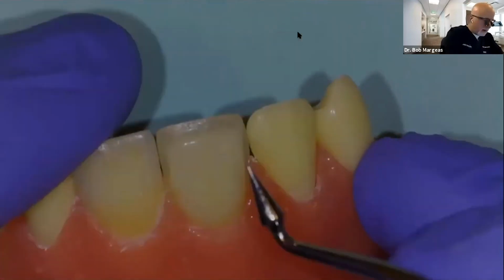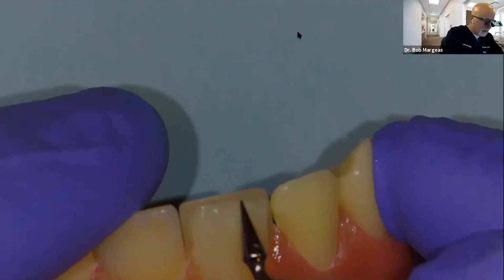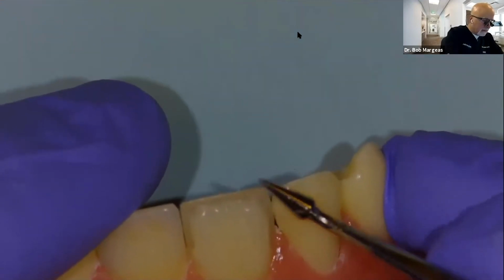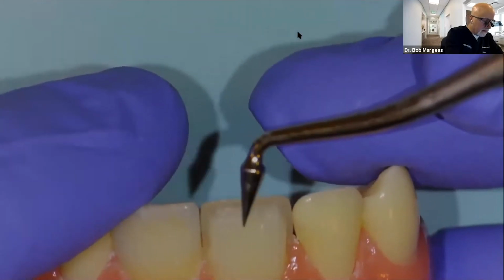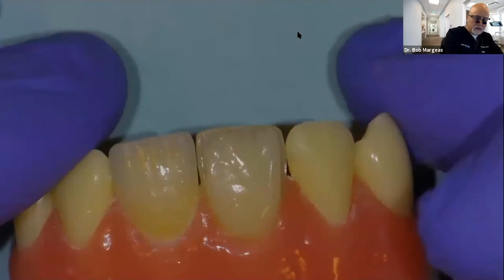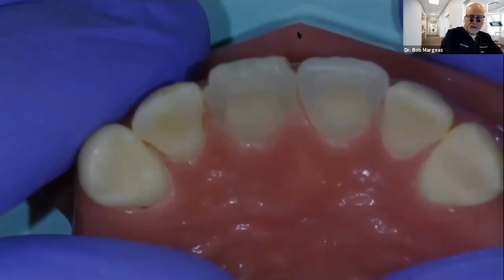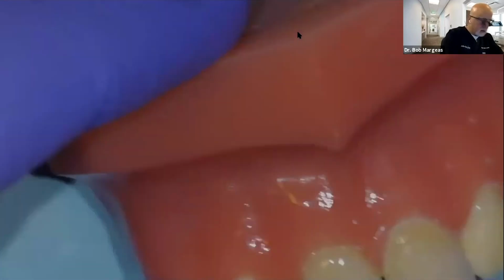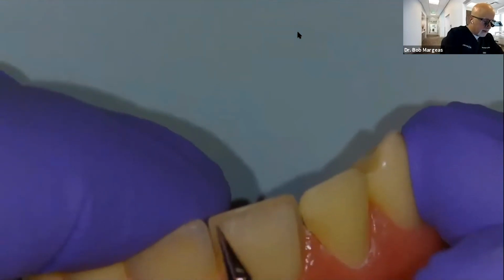So now I want to be able to create those dentinal lobes. So I'm actually splitting the material, keeping it short of the incisal, trying to determine how much material you need. If you look at this, you can see I'm a little bit over contoured, not bad, but I've got to try to create these developmental lobes similar to what I see on the adjacent teeth.